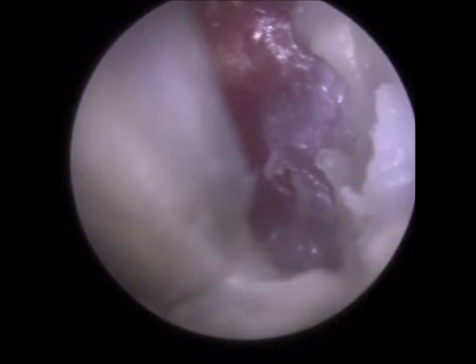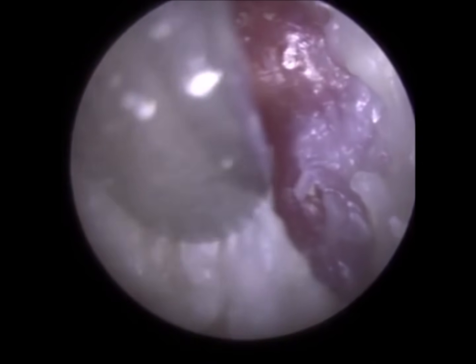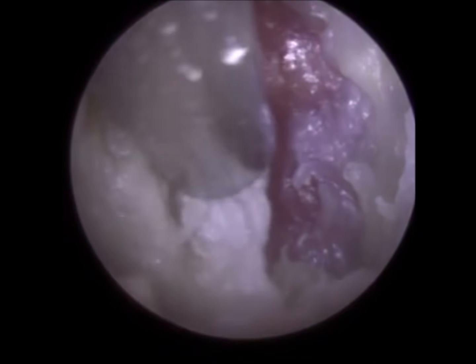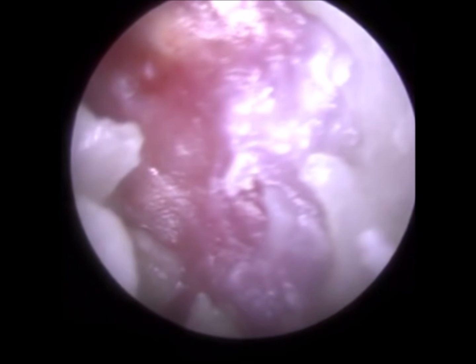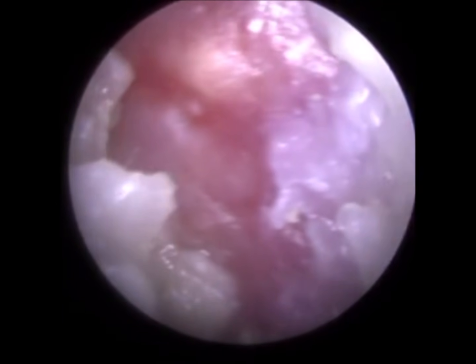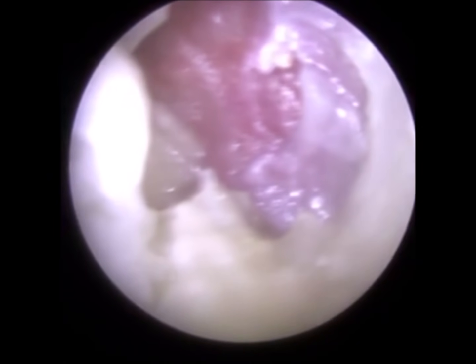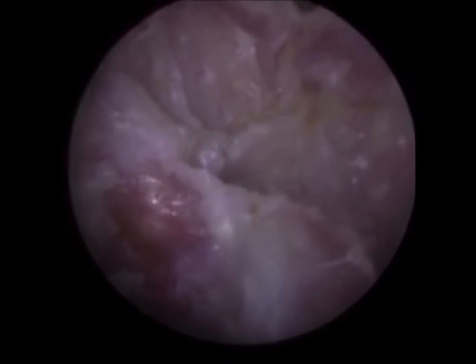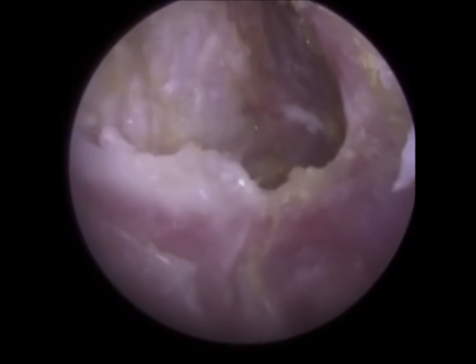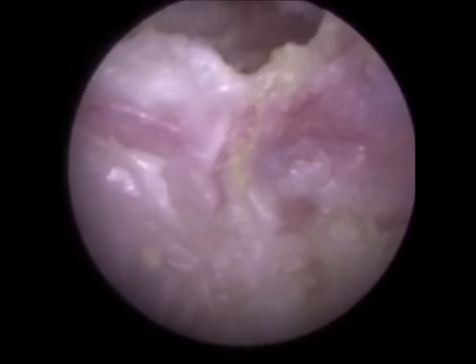And imagine going in there with an ear hook and digging it out. You don't really want to do that if you can avoid it, because you just don't know how deep this erosion is. You'll be scratching the base of the ear canal, the side of the ear canal. There we are. You can see a lovely view there of the perimeter of his original ear canal, and that's the patient's eardrum. This is the back part. I'm just having a good examination now. So that's crater 1. This is right at the base of the ear canal. This is crater 2 coming in a moment.